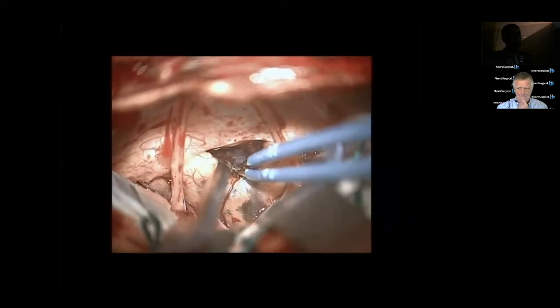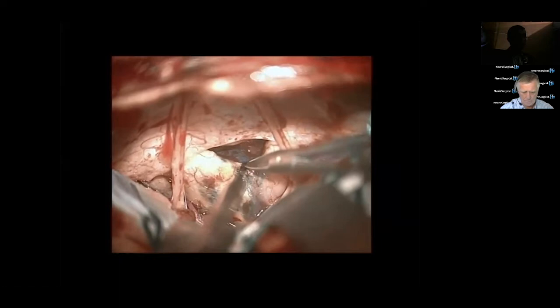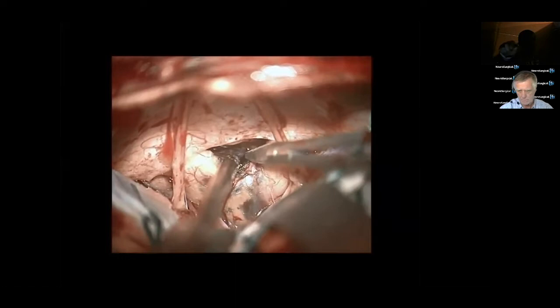If you can't see the extent, distance. Yes, of course, you can see it like this. You can see it, as I said, these are the fibers of the chiasm. So you are seeing it through. So it has gone through here, it has gone through here. That's why she has the bitemporal and the crossing to the other side defect.